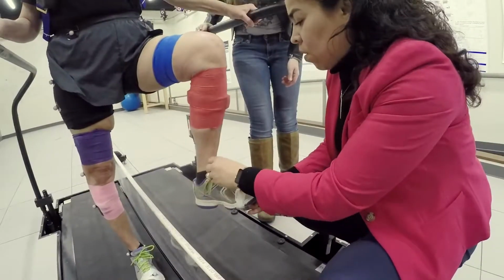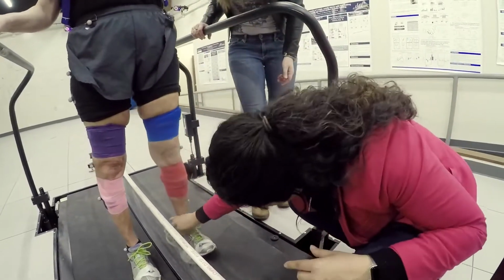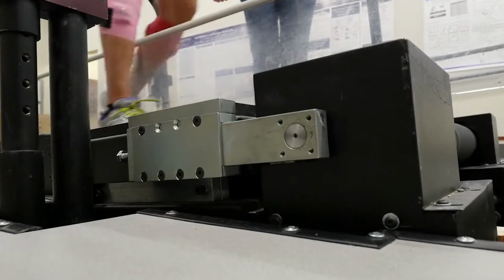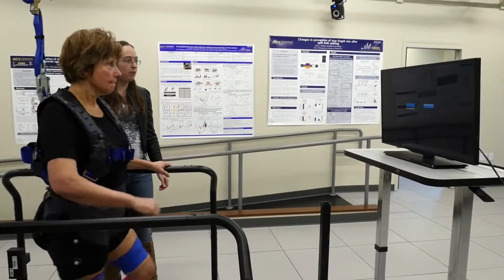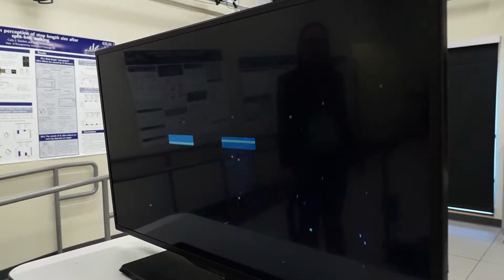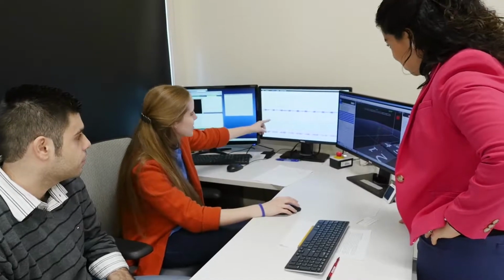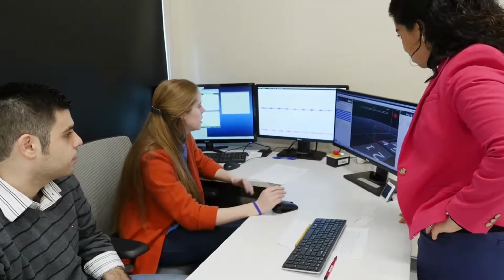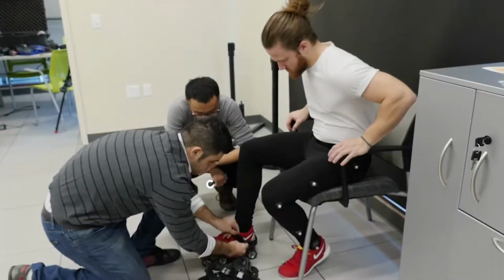They're tweaking their methods to see if they can make that happen, like switching up the speed of the belts and changing the incline. They even have the test subject play a video game of sorts, trying to step on targets. And we thought, well, perhaps if we give them feedback telling them where to step, maybe they will be able to correct their gait better.